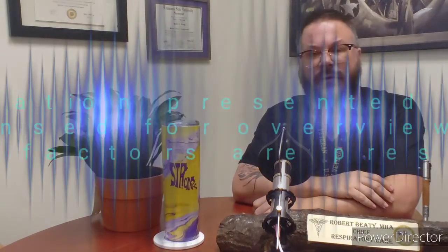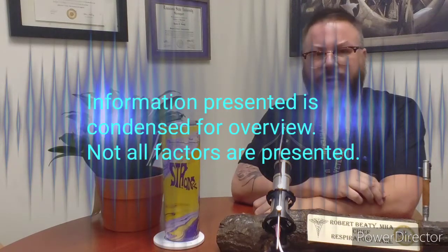Today we're going to be talking about an advanced mode of mechanical ventilation known as APRV, or airway pressure release ventilation. This mode is often associated with ARDS and acute lung injury because it's an open lung strategy that aims at improving oxygenation while reducing the risk of barotrauma.